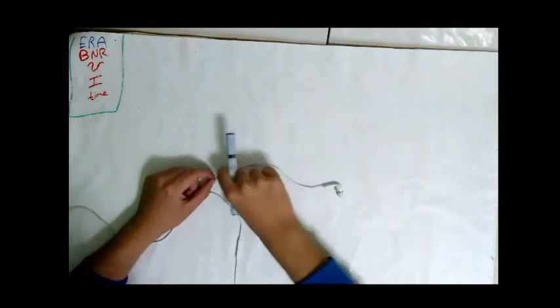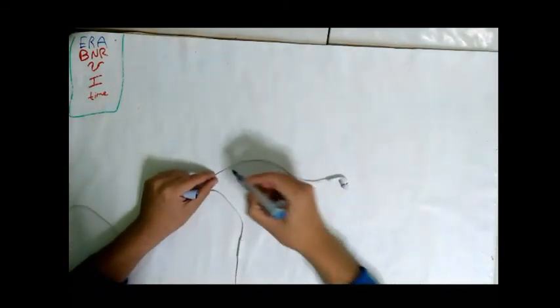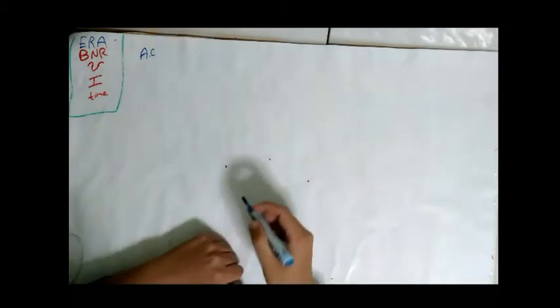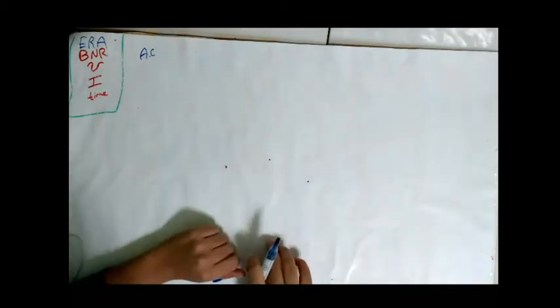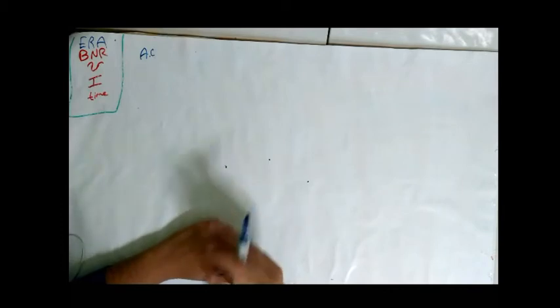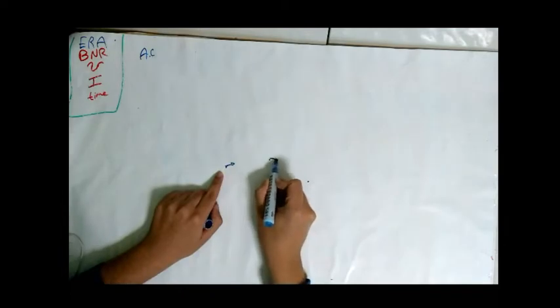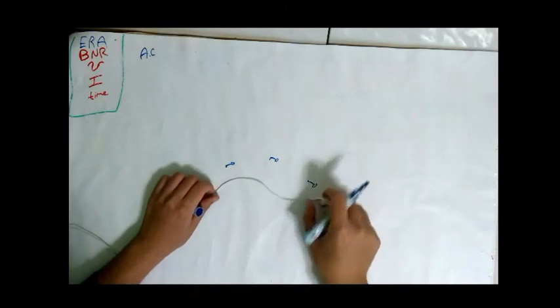Let's first look at this wire. The current or electrons in this wire is called alternating current, not direct current, and you will know why it is not direct current. The electrons and atoms in alternating current move in different phases. In the first phase, they will move forward toward the transducer head or the earpiece.